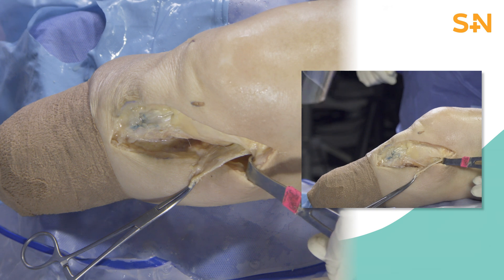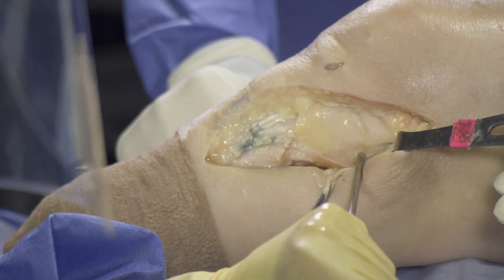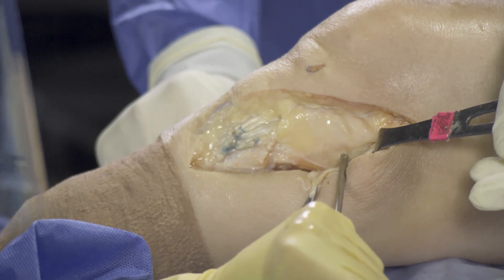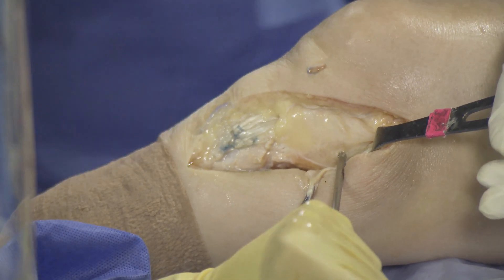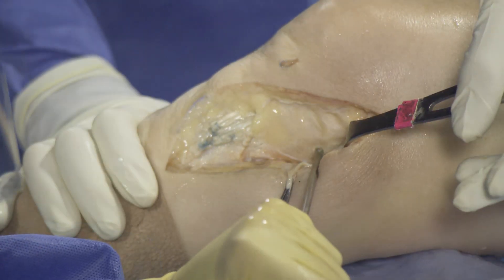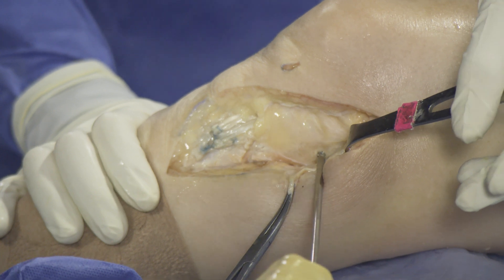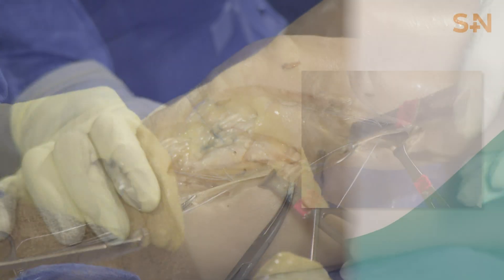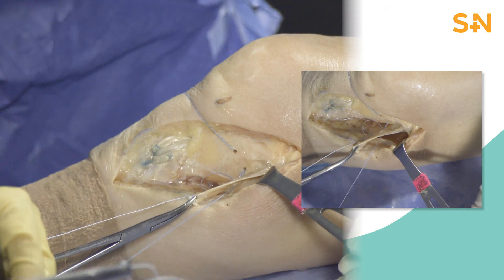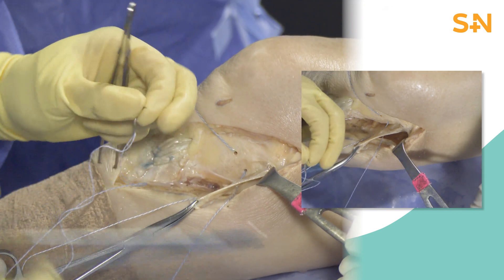In this double row technique, we will recreate the proximal and distal insertions of the superficial MCL. Using the QFIX single-loaded 1.8 mm all-suture anchor, we will place two proximal anchors 1.2 cm below the joint line. These sutures are then passed through the distal MCL and tied into place to repair its proximal insertion.